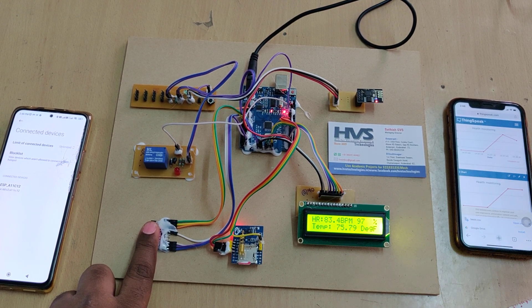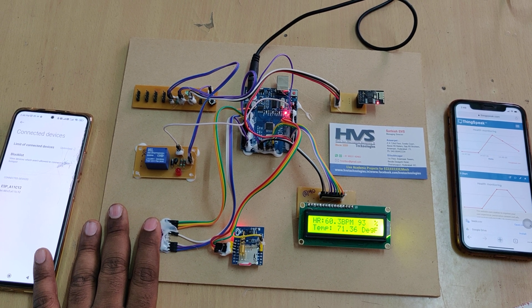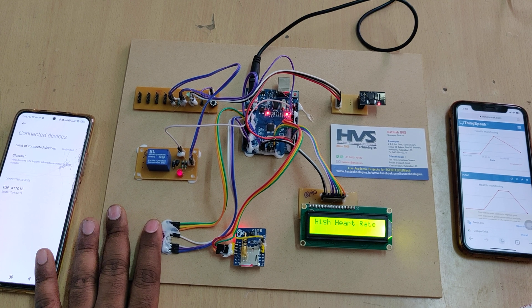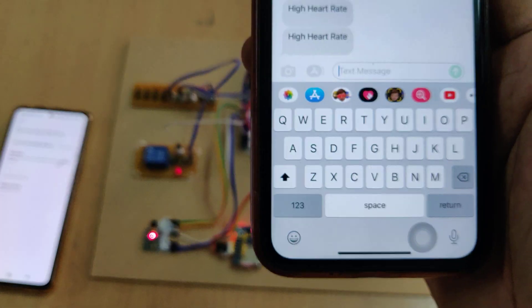New data is now being received — make sure to place the finger properly on the sensor to get accurate values once the heartbeat sensor stabilizes. After stabilization, moving the finger causes the heart rate to increase and the system sends an SMS alert saying 'High Heart Rate.'